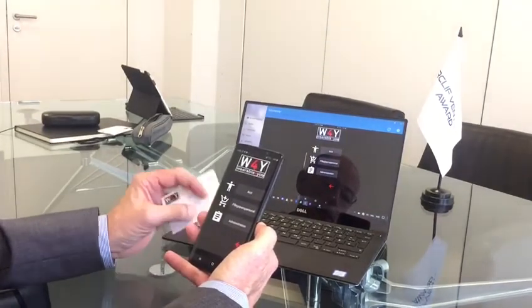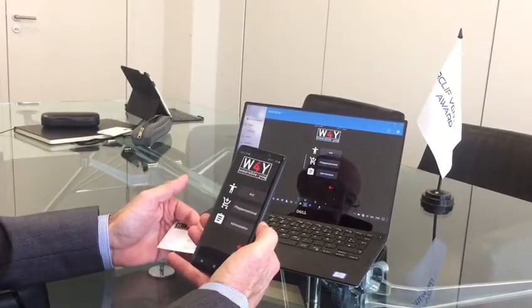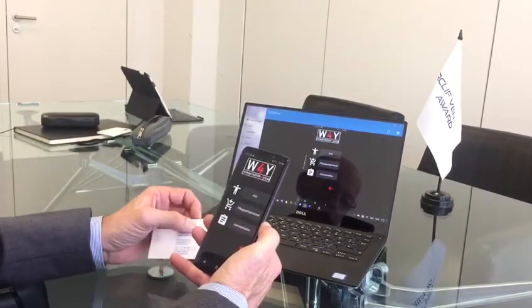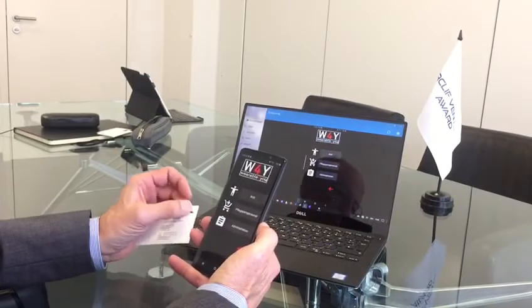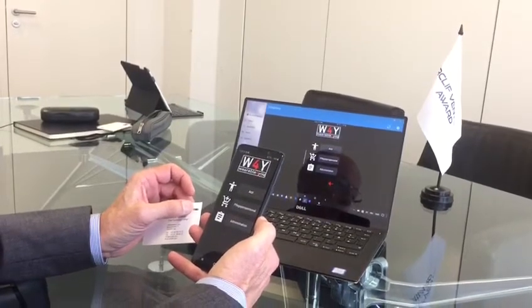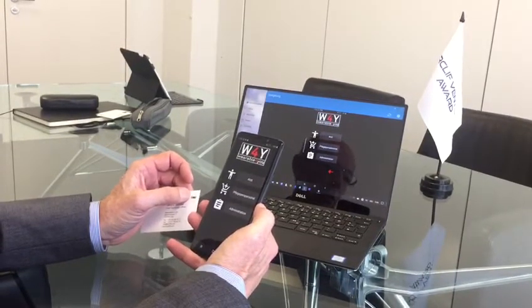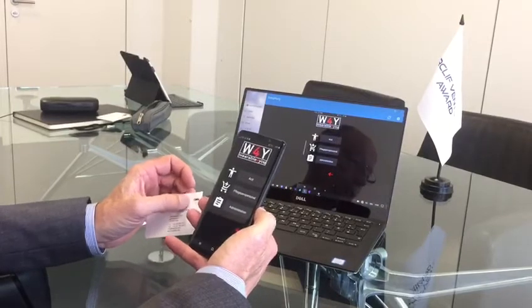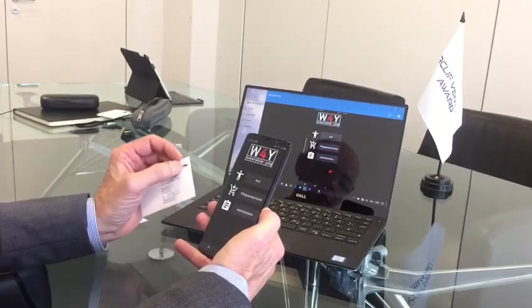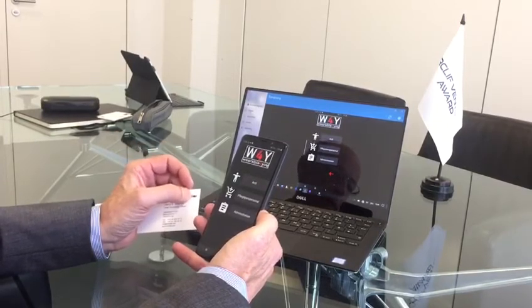And by the way, the programming of this chip is very easy. Once the patient enters the hospital, his data are either already in the system or are programmed in. The chip is programmed, put on the patient's nail, and that's it. And the very moment you remove this nail from the patient, the nail is destroyed. It's also a fail-safe protection or fraud protection. If somebody intentionally or unintentionally removes this tag from the nail, it's guaranteed that it cannot be applied again.